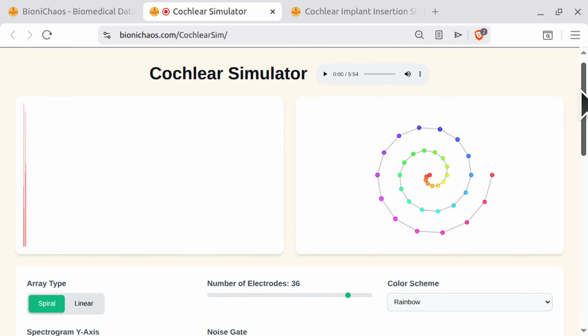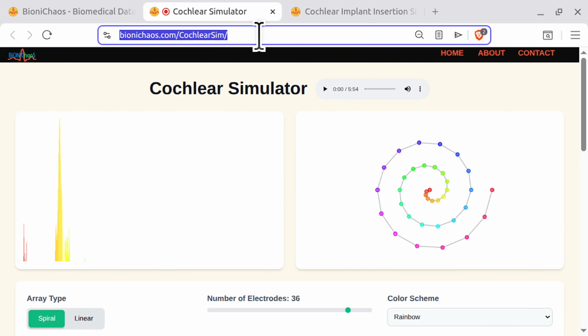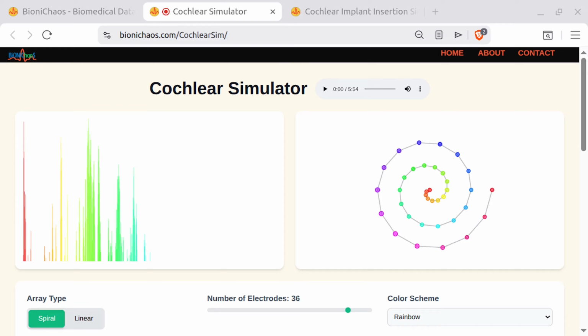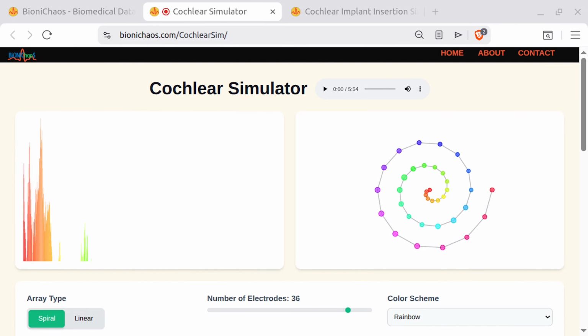It really is. We tend to view medical interventions as binary, right? You break a bone, a doctor puts it in a cast, the bone heals, and the story is over. Yeah, it's fixed. Exactly. But a cochlear implant is not a cast. It is a lifelong, highly unpredictable marriage between human tissue and a machine. It is. And to set the baseline for the discussion, a cochlear implant is an electronic medical device that physically bypasses damaged hair cells in the inner ear. It basically takes acoustic sound, turns it into electrical signals, and directly stimulates the auditory nerve. Right. So it has fundamentally transformed the landscape of sensorineural hearing loss.